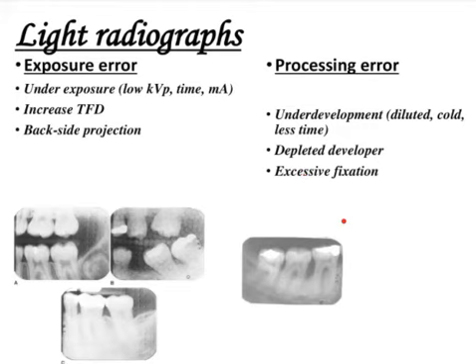Also, if you are keeping the film in the fixer solution for a longer time, then the fixer is going to remove the developed areas, that is the black areas also. That is why it is instructed, especially when you are working in a place where it's completely or partially film based dentistry, that you do not forget to take the film out from the fixer solution after the specified time.